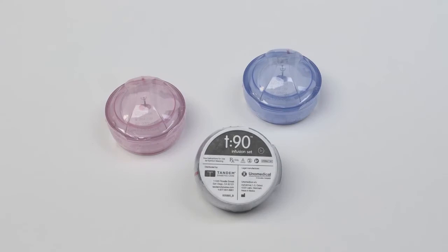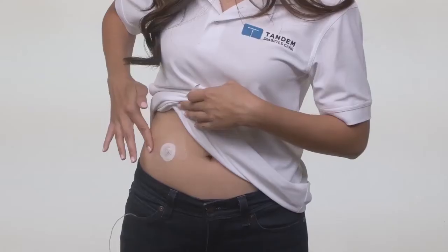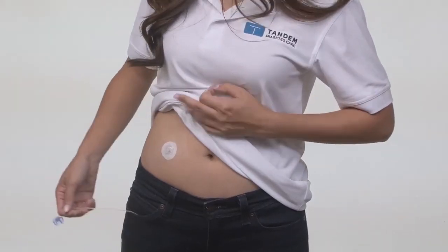Your infusion set should be comfortable, secure, and allow for the free flow of insulin. In this video, we'll review some basic tips for making sure your sets stay well attached until it's time to change them.